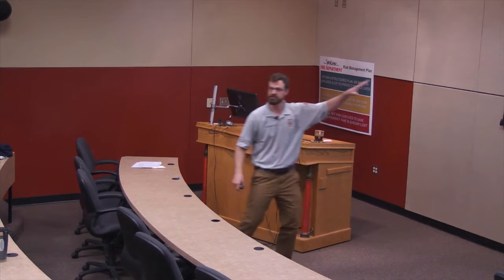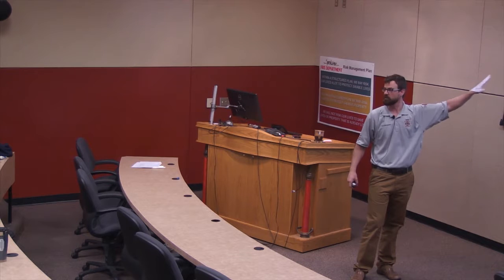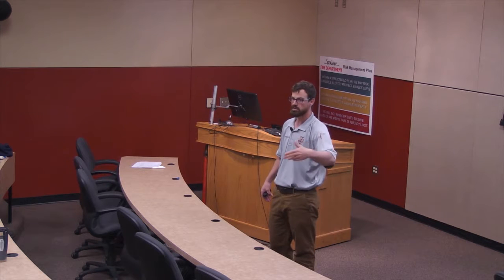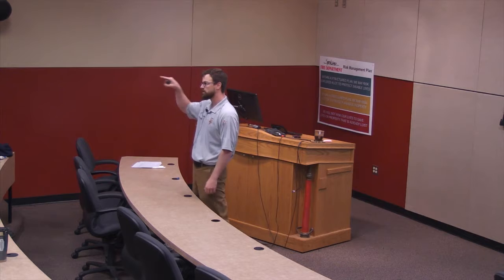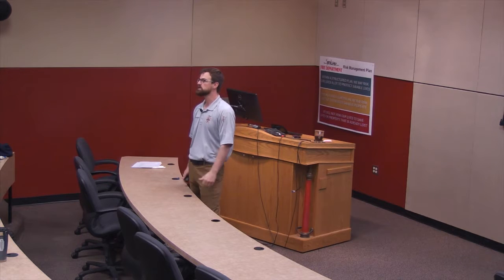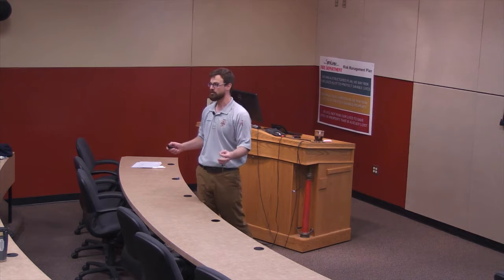So the anticipation of what could come down the pipe is what we're doing with the long QT. It's not that I'm going to do anything about it, like in a wide QRS, where I'm going to treat with bicarb. In this circumstance, I'm just telling myself, something bad could happen. I've got a setup for it. I see the interval is off. This is how long QT happens. I'm going to be prepared for it. So when it happens, I was expecting it, not caught off guard by it.